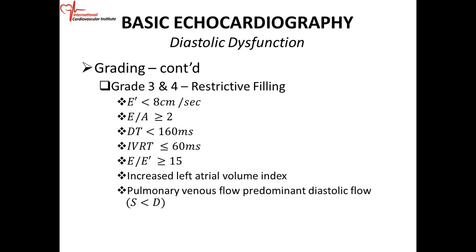We call it a problem with compliance. So the first two, 1 and 2, is a problem with relaxation, and then 3 and 4 is a problem with compliance, restrictive filling. And restrictive filling has a very specific pattern.